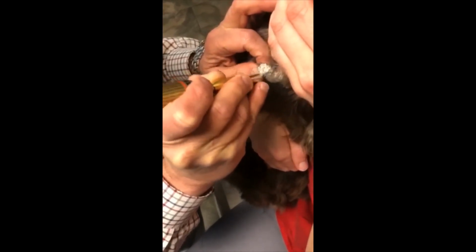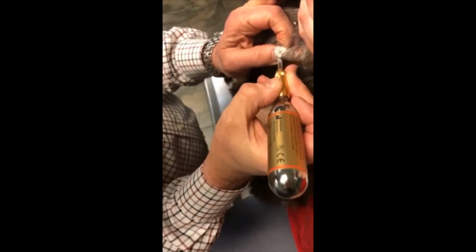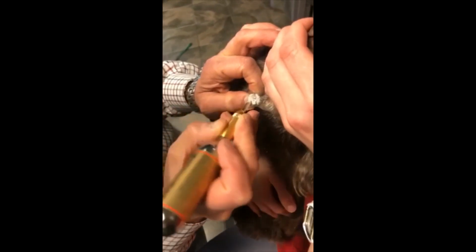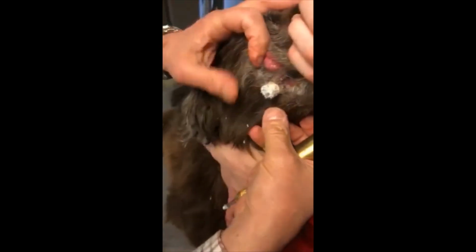The goal here is to freeze as quickly as possible so as to form ice crystals intracellularly and rupture the cell membranes to ensure that you have a complete freeze. With a tissue this size, the depth of the tissue is such that you need to ensure that you have the mass completely frozen. That's what the mass looks like post-freeze.